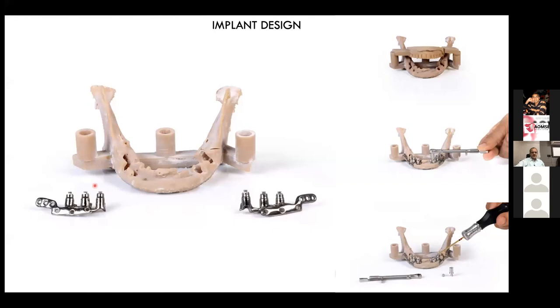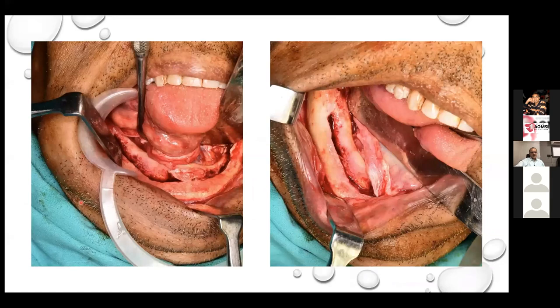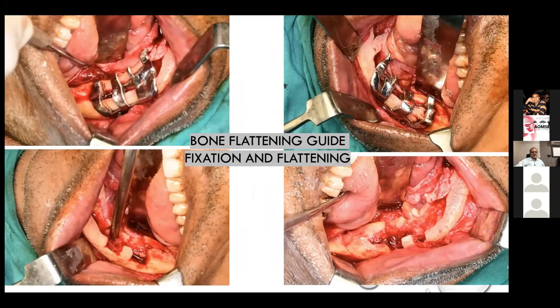You can see this abutment. You can't see the screw. This is an exposure only on the two sides, keeping again the mucosa. Since there is a ditch created because of the mucormycosis, you have to give something which can actually go below this. So this is a cutting guide, and after the cutting guide, you have to remove precisely the same amount of bone to create the depth to accommodate the implant. So you can see here, once the implant is fixed in this region, the entire assembly actually goes below the bone level. Only the abutment part remains above.